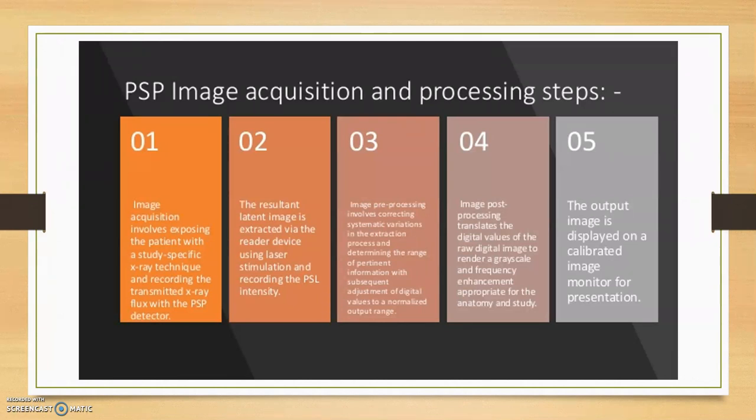So if the same image receptor is used, this process must be repeated for each different position, including the time to erase the image stored on the plate. This can be kind of a lengthier process when the patient may be in pain or waiting for you for the next action. Erasing the data itself takes about 45 seconds in addition to the 25 to 90 seconds it originally takes to read the plate, or display the image.